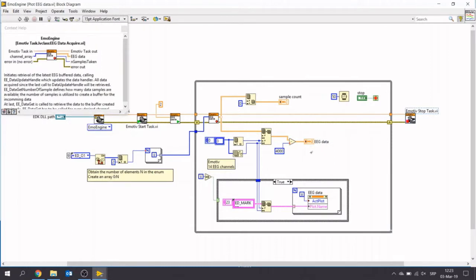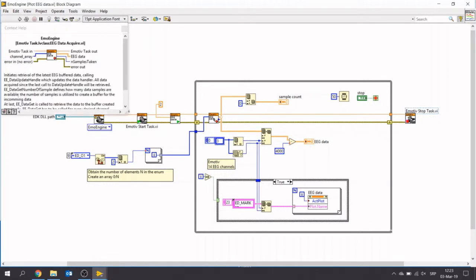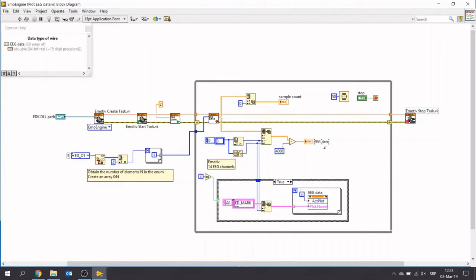This while loop is refreshed every 50 milliseconds. That is with this block specified here. And of course, like every while loop, when the user presses the stop button on the front panel, the while loop stops. Okay, so as the output of this block, we have 2D array, so a matrix in which first row is sample count and all the other rows are EEG data. So we need to divide this matrix to one row of sample count and other rows for EEG data, other 14 rows for EEG data.